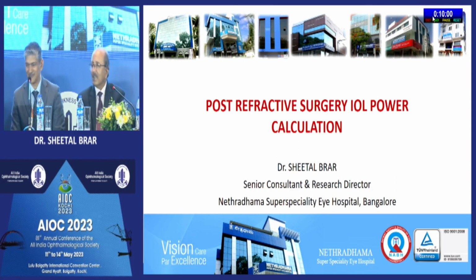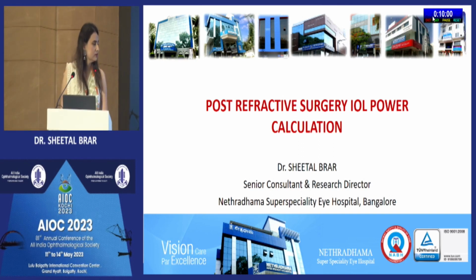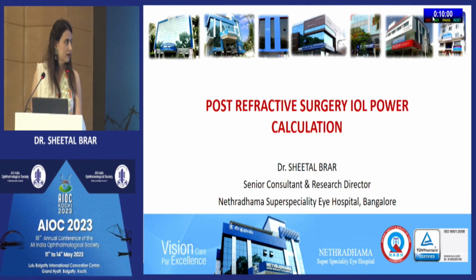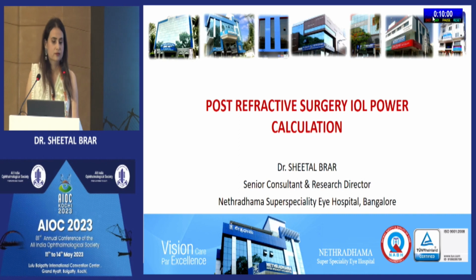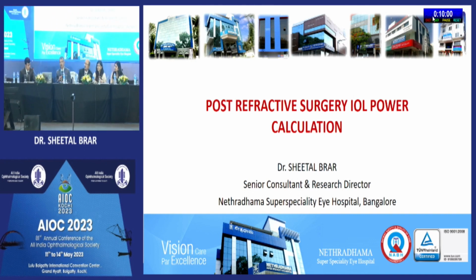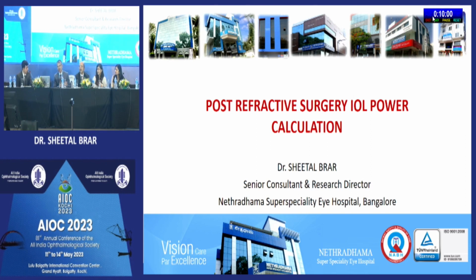And the very important tip there is that many of us use the irrigation cannula inside and then inject the IOL, but that is only suitable for push type injectors. You can't use it for screw type. But this tip of hydrating and then just directly going can be used for any type of injector. Any type of injector, yes. See, in an open situation like SICS or ECCE, you need the chamber to be maintained by viscoelastic, otherwise it collapses. Here, if you are doing a wound-assisted injection, there's no way the BSS can escape from the eye until you inject the lens completely, and it remains stable, and it works very well in my hands, at least, and this is what I've been doing for a few years now.